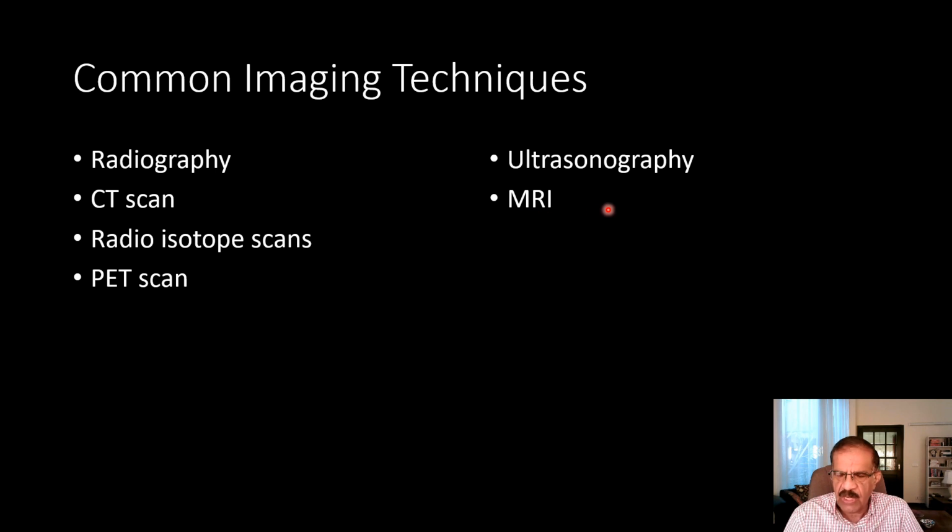MRI is another test. It is very much similar to CT, but it does not need radiation, so it is considered to be relatively safer as compared to CT scan, but it is much more time consuming and is more expensive also, and we have a separate lecture on MRI also.